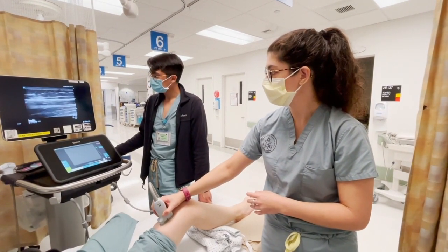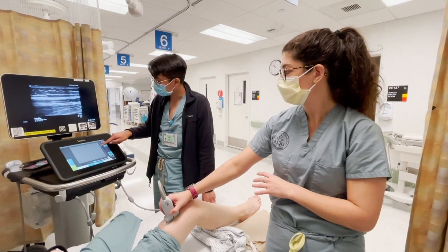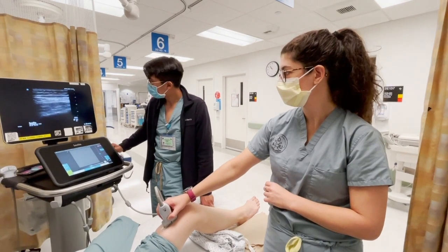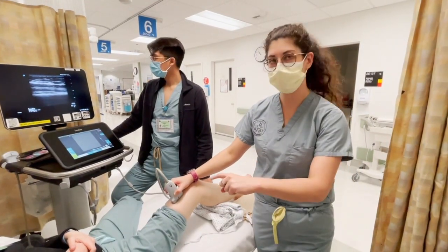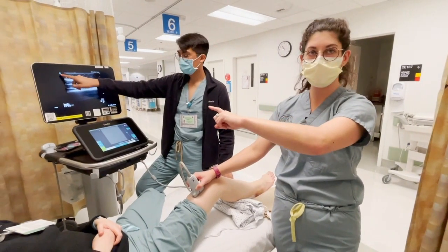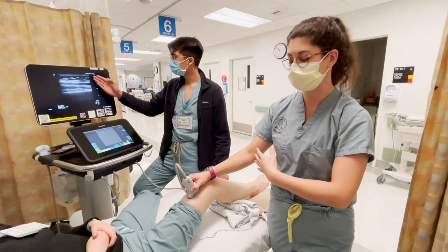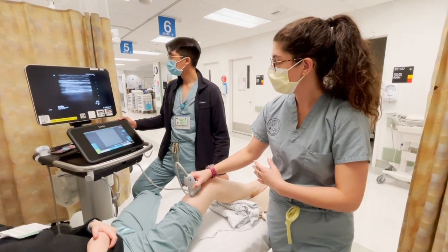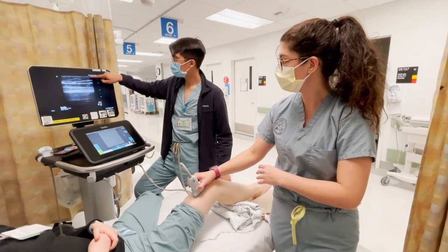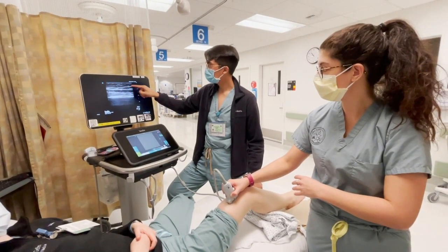Make sure when you start that your depth and gain are appropriate to what you're looking at. We're going to start scanning in the sagittal plane with the indicator dot towards her head. As we scan down, we can see the different layers within the leg: at the top we see the skin, followed by the subcutaneous fat, followed by the striations of the muscle.